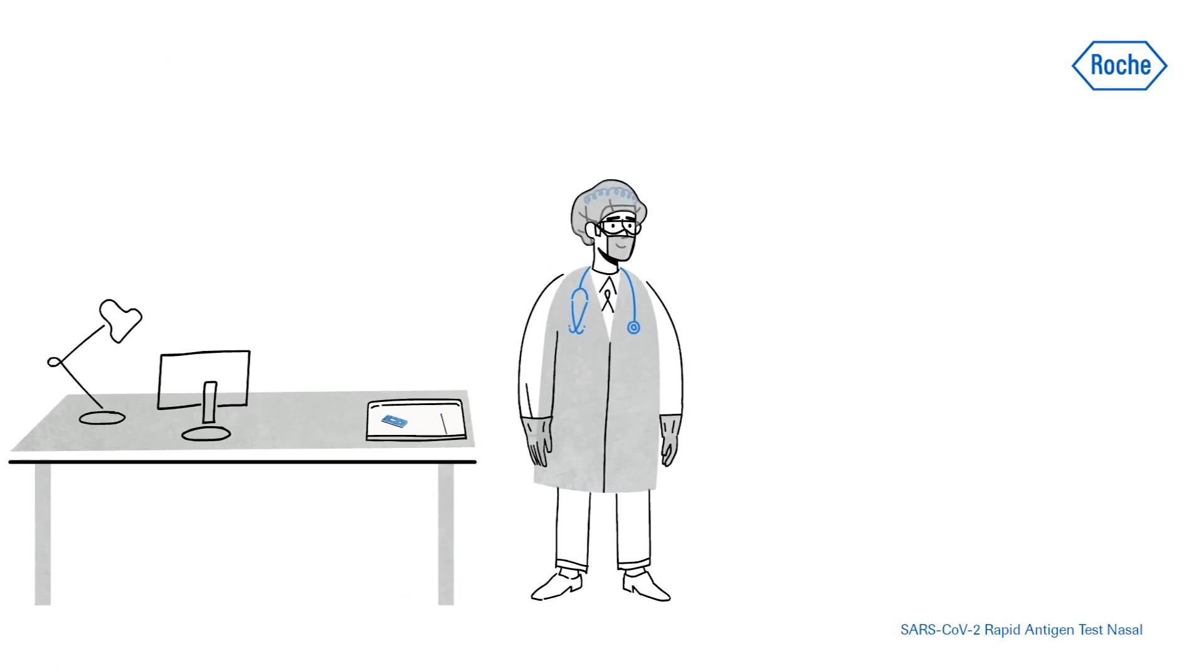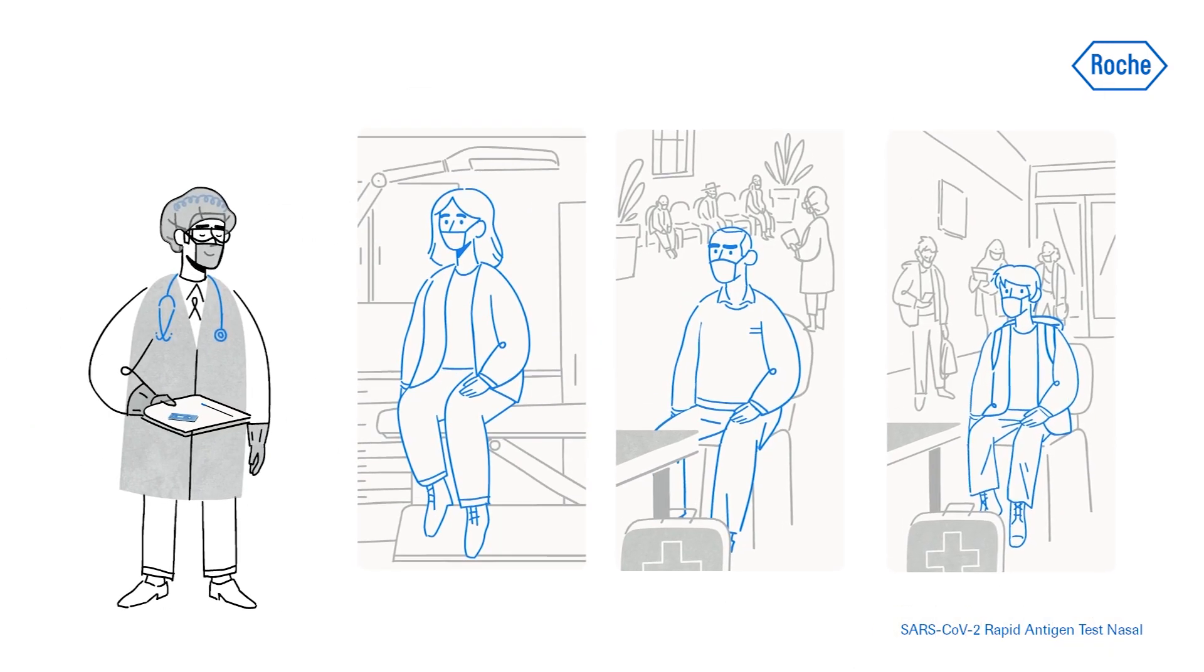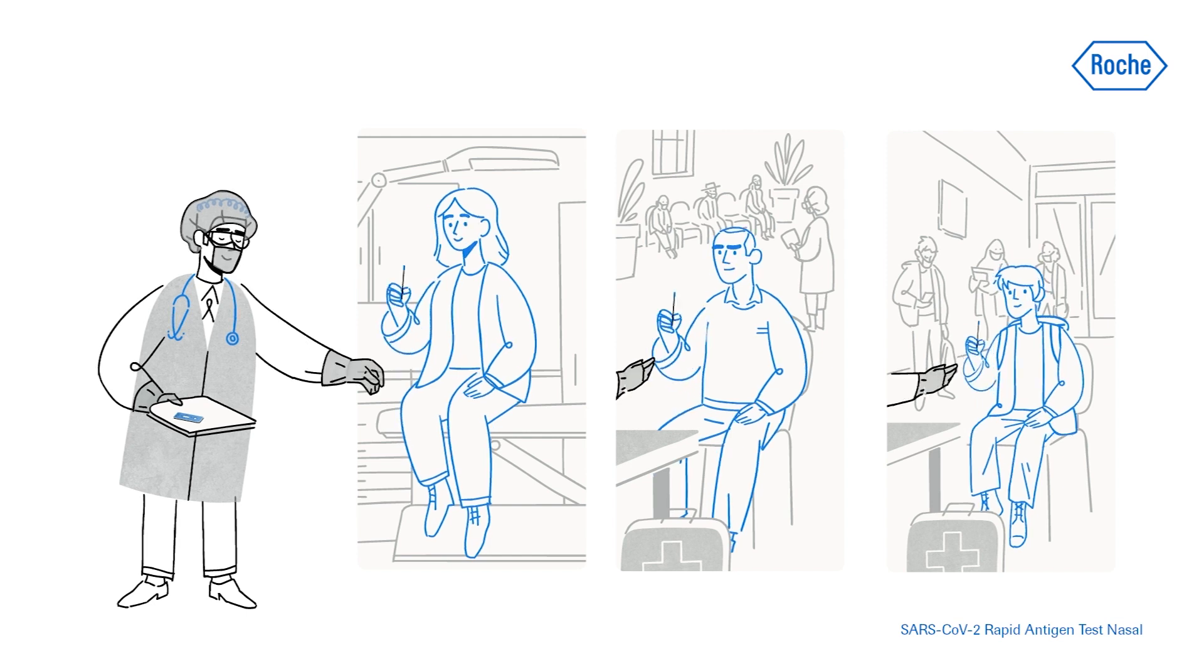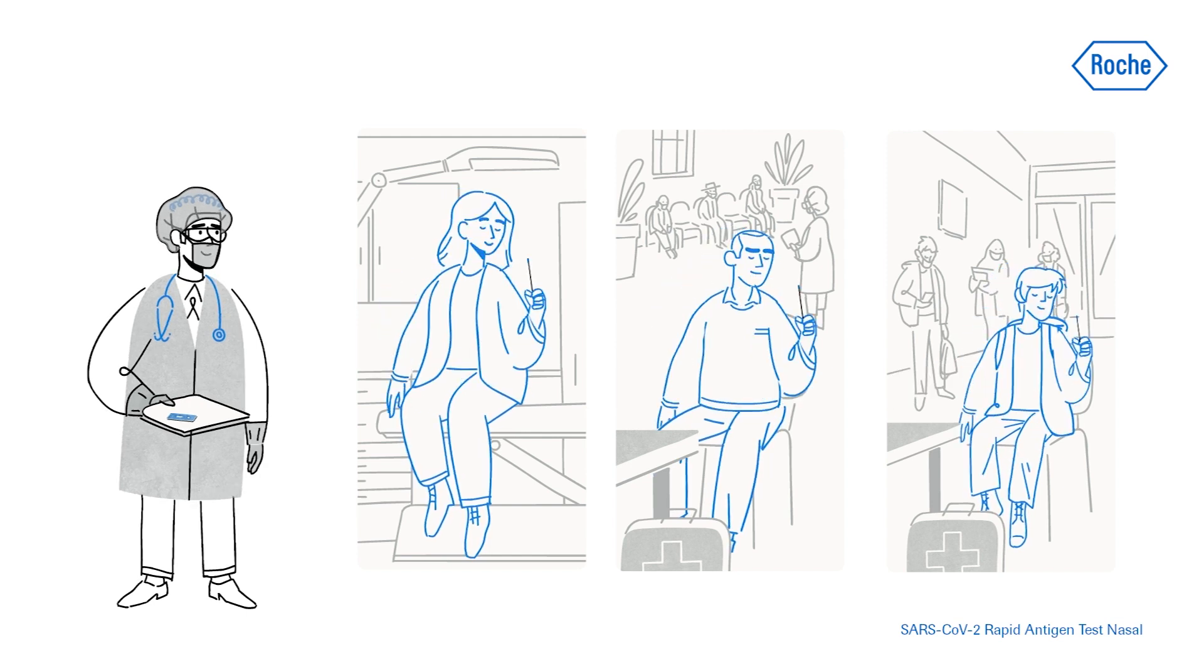Intended for use in point-of-care settings, the test is ready to use by healthcare professionals. The nasal swab sample may be self-collected by patients under the supervision of a healthcare worker.